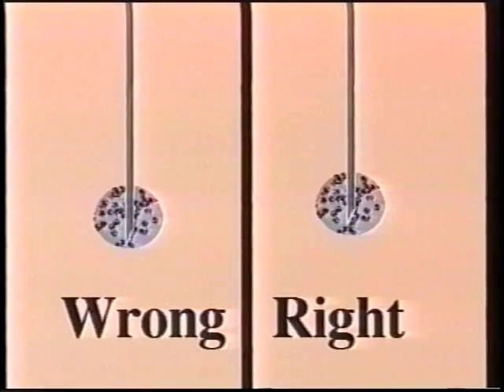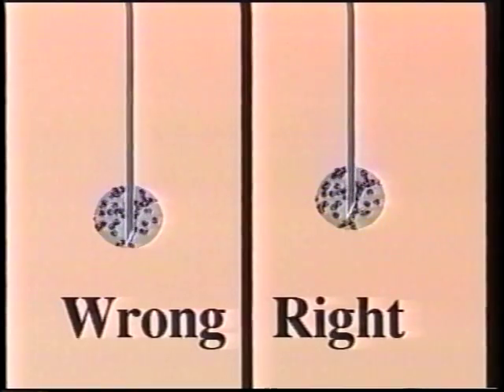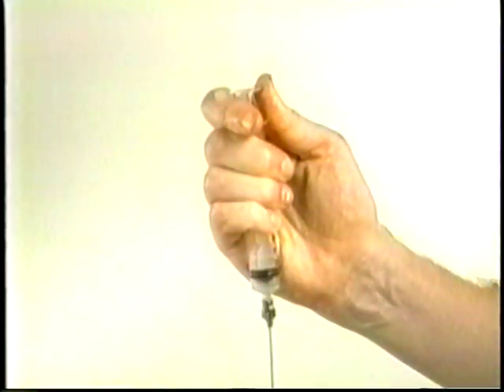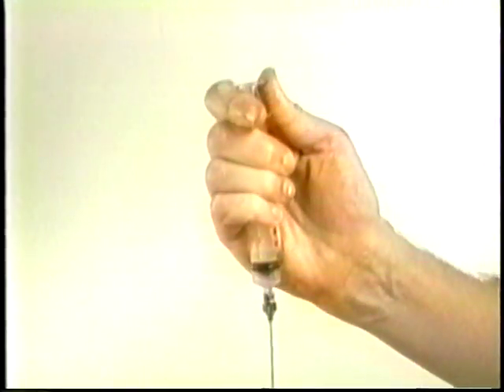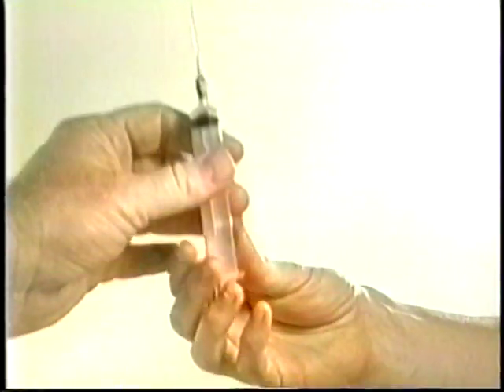It is crucial that the needle tip is truly moving through the target. Rotating the needle does not appear to improve the harvest. After the sample has been collected, the suction is released without delay. The needle with attached syringe is pulled out and immediately handed over for preparation of smears. Time here is of the essence.